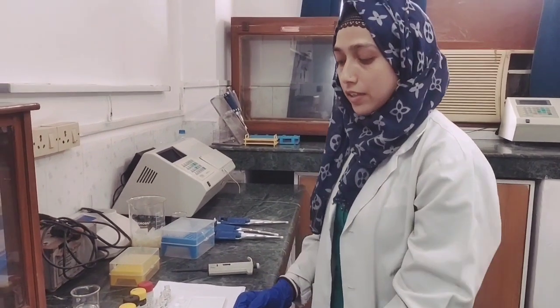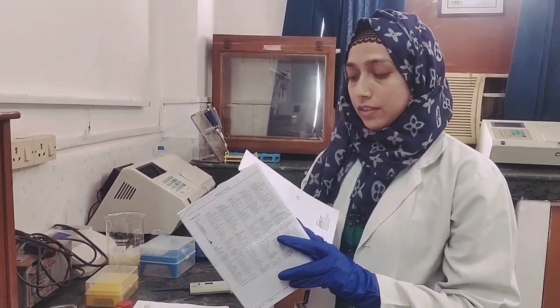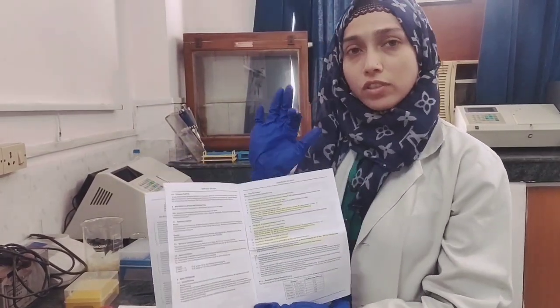Before proceeding with the test, first we have to standardize our kit using these standards. Then we can proceed with the test procedure. So now we will start performing the standardization. This is the guide which we have got along with the kit, and this is the protocol written here, the test procedure. We will follow this procedure to perform the standardization.